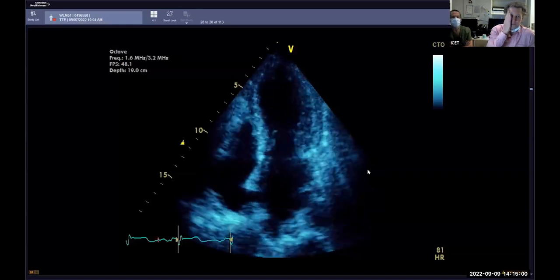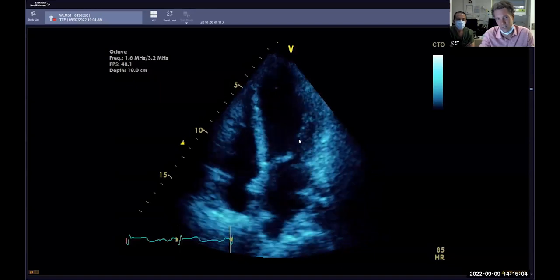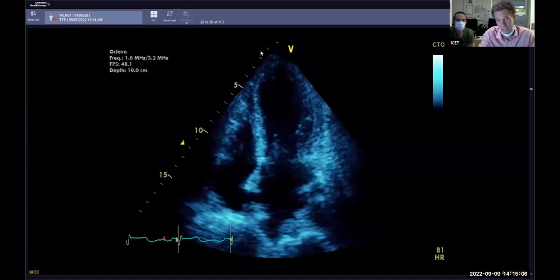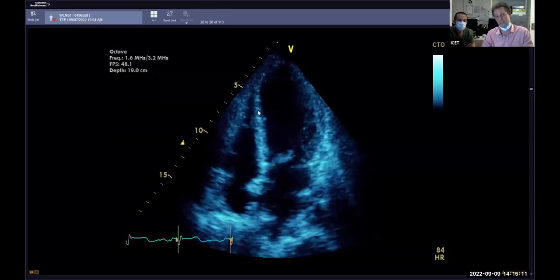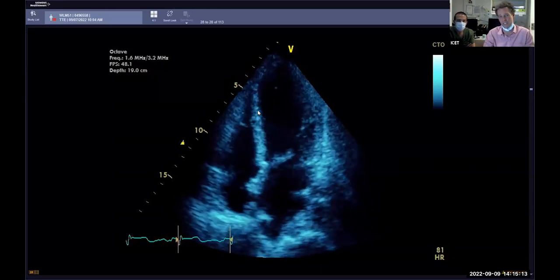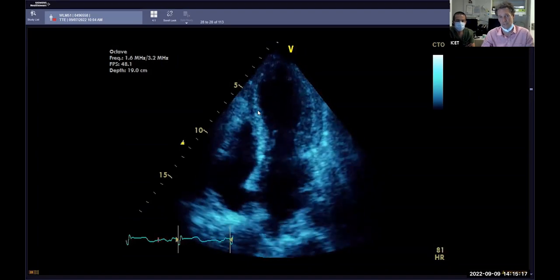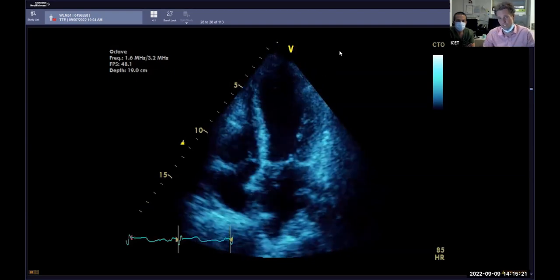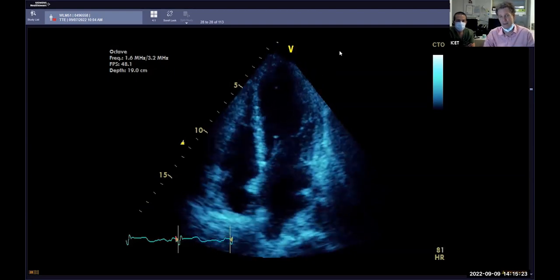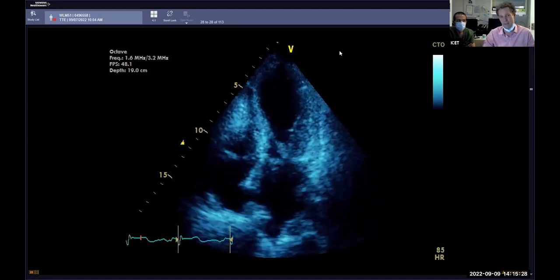Yeah, beautiful. So you said the Takotsubo is what this looks like. I think it absolutely could be, but it's a diagnosis of exclusion. You've got to exclude coronary artery disease, because the other thing that can look like this is obviously LAD territory infarction. So you've got to exclude LAD territory infarction, and that's why obviously this lady needs to go for an urgent cath, because I think the two treatments are obviously slightly different.